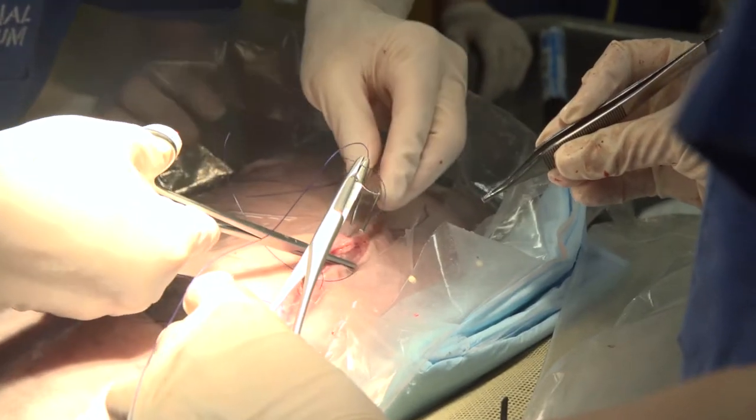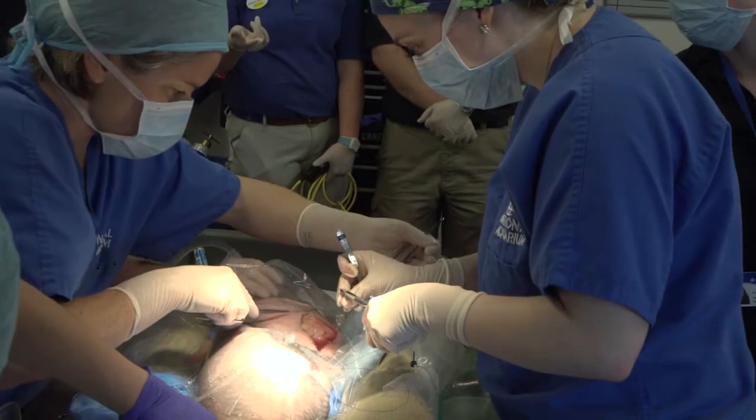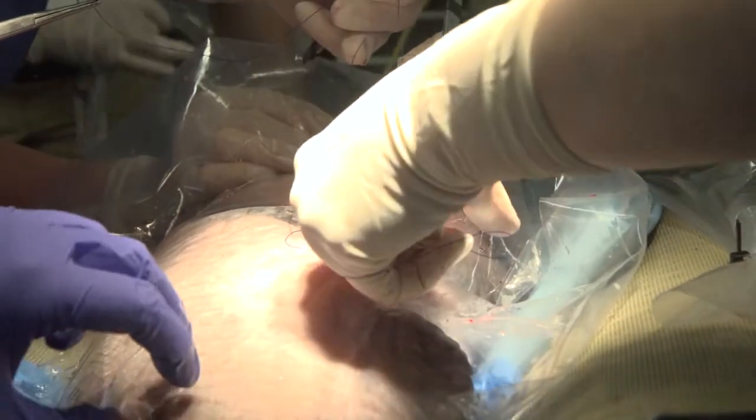We looked around at the other organs to make sure nothing else looked abnormal, and everything looked pretty good, so we were ready to go ahead and suture her up at that point. We do two layers of suture in fish — we close the body cavity and then we close the skin.